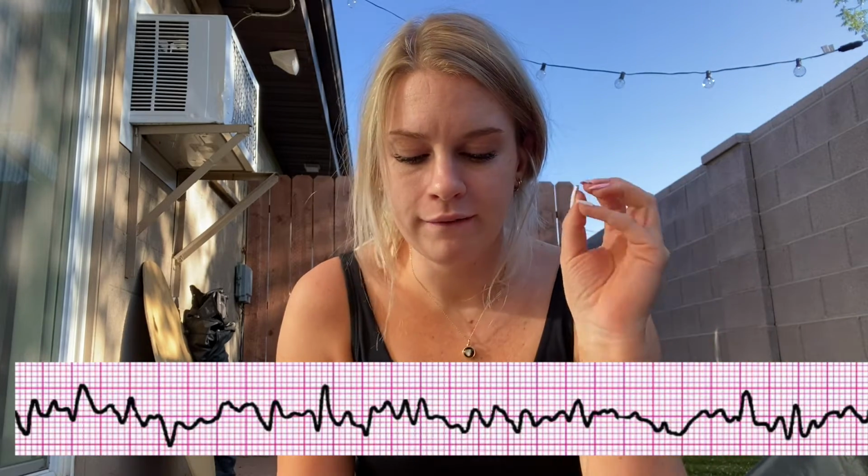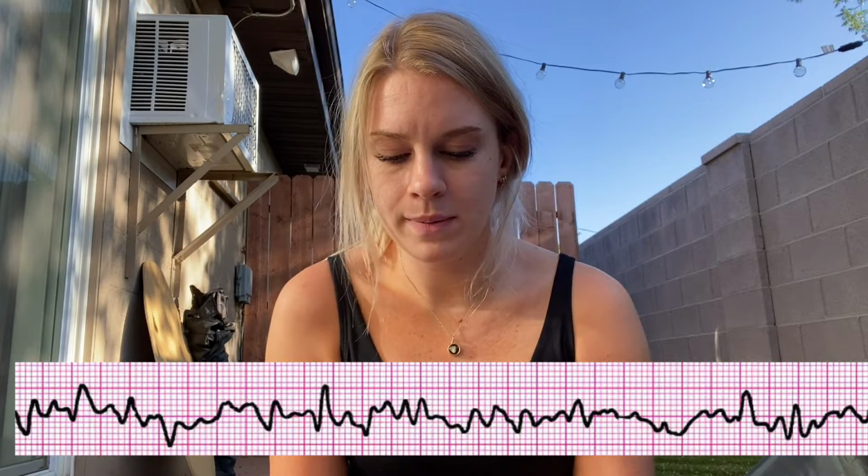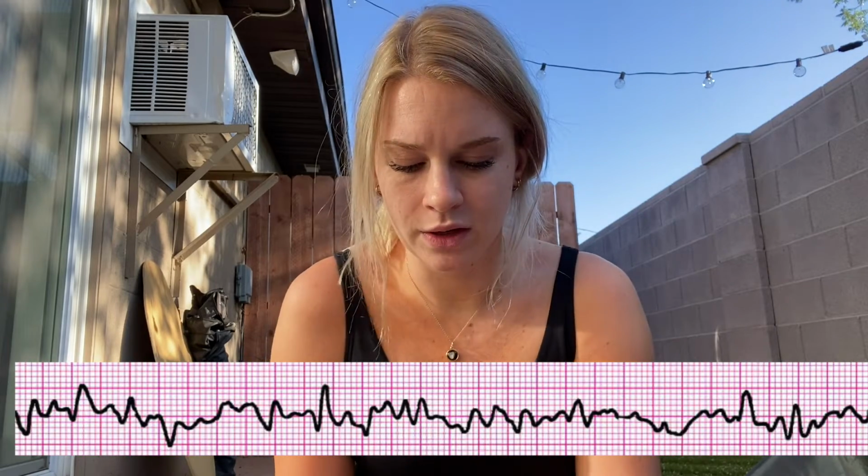So we were last on V Fib, so that's ventricular fibrillation, and it stems from multiple ventricular ectopic foci. So those are the cells that are going crazy and trying to take over the sinus node. The defining characteristic of V Fib is a squiggly weird line. An artifact can mimic V Fib, but literally no one is awake in V Fib. That's not a life-sustaining rhythm. And it's always an emergency, so treat it as such, even if it's just artifact, because you don't know.